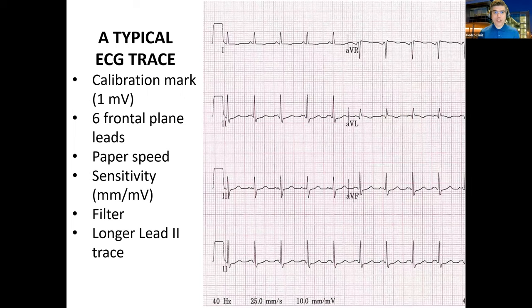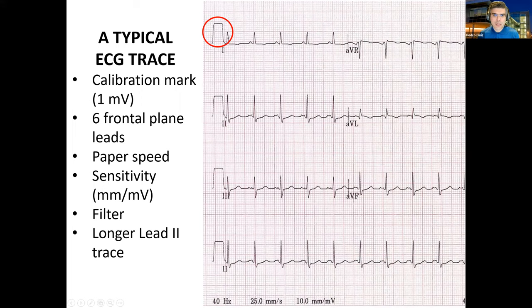Every single ECG should have some important markings, whether computer-based or paper-based. The first marking is the calibration mark, which indicates the sensitivity of the equipment detecting electricity from the heart. Here we see a marking of 1 millivolt, which is 10 millimeters — 10 little boxes — showing 1 millivolt in amplitude. Sensitivities can be twice as big or half of this, depending on the size of the QRS complexes on the ECG.